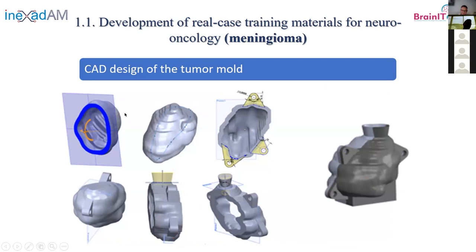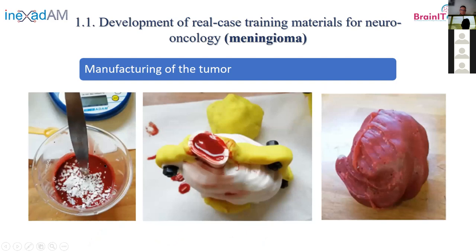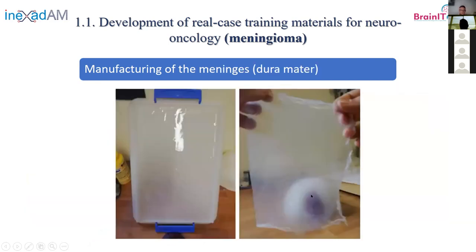To make the tumor, we used the previously segmented STL file. We cut and divided it into two parts, added tabs, a hopper, and a cube to stabilize the mold. The idea was to pour the silicone with pigments and crushed PLA to mimic the calcification inside the tumor. Here you can see the 3D printed mold of the tumor, the mixture with the PLA, pouring into the mold, and after the curing process, the final result. The yellow is just some plaster to seal the mold.